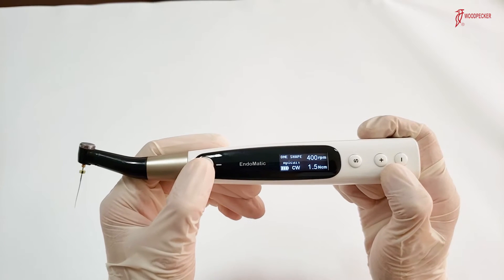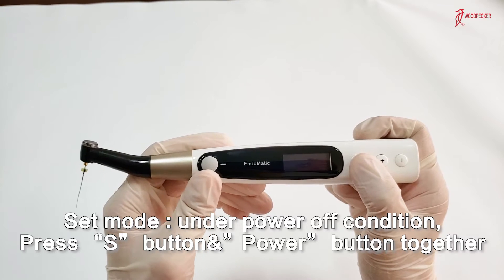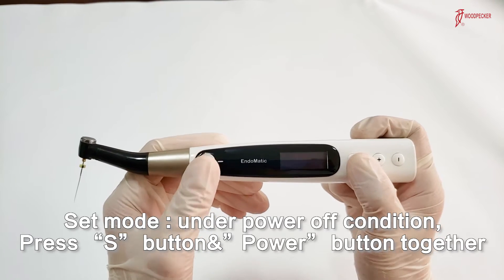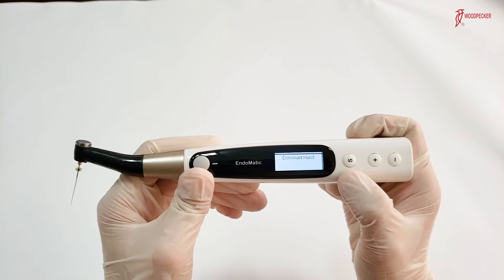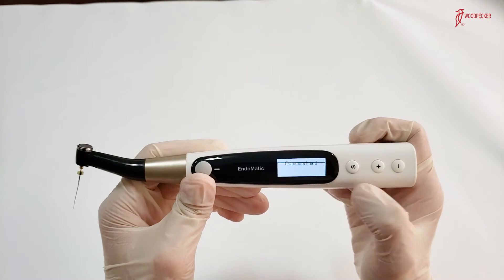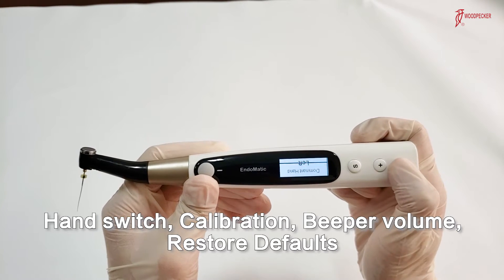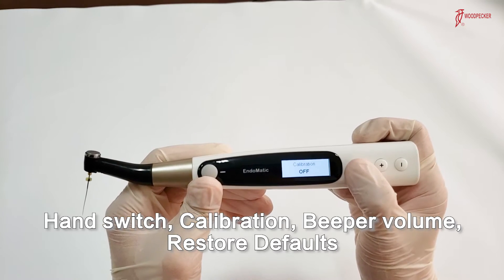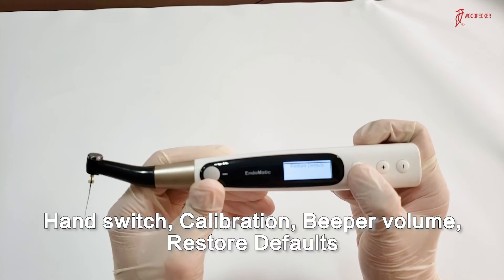There are some additional small functions. Switch off the device and press the S button, then press the power button to access them. These include left and right hand switch, beep volume, and restore defaults.